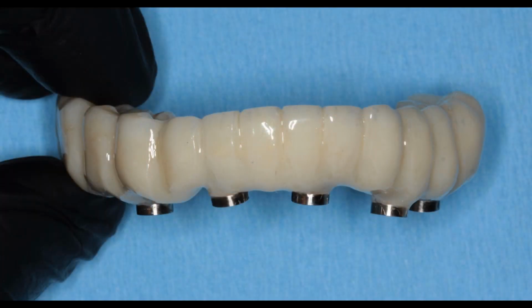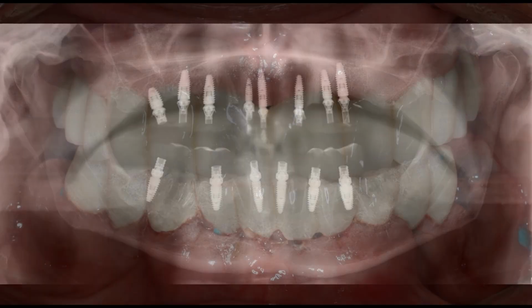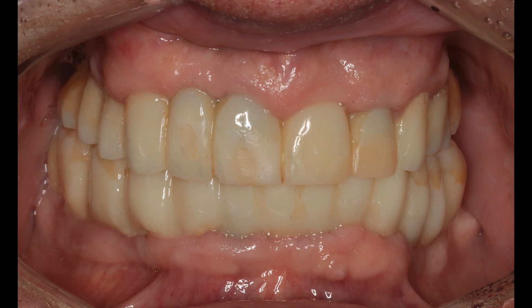We did his lower 2 or 3 months later. Same technique. He leaves here with a temporary that day. So his upper's been in there for 3 months now. His lower has just gone in that same day. And then this is what he looks like 3 months later.